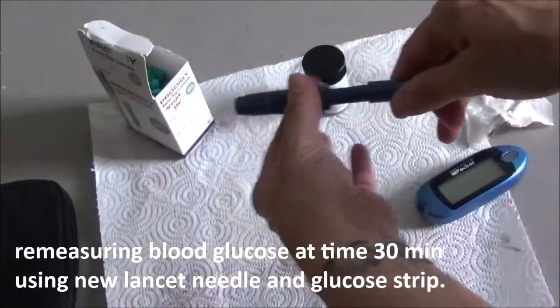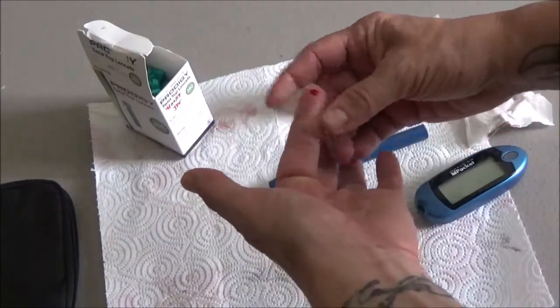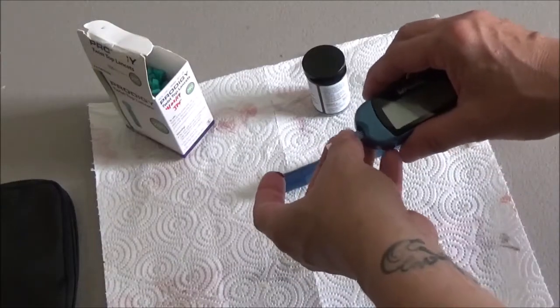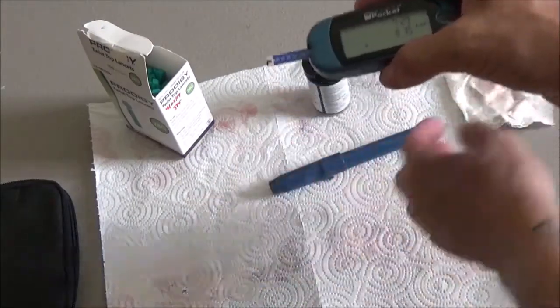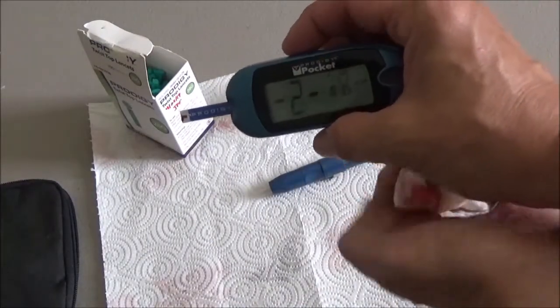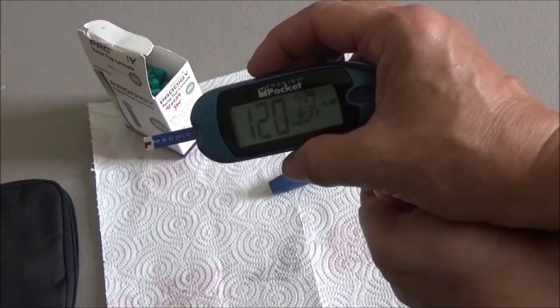All right, gotta make sure that's cocked and ready to go. Okay, all right, got a blood sample. If you're queasy, this might not be for you. All right, and when it's got a full charge on the glucose meter, it'll time down. Ooh, 120. Okay.